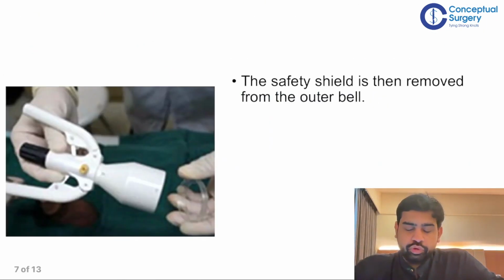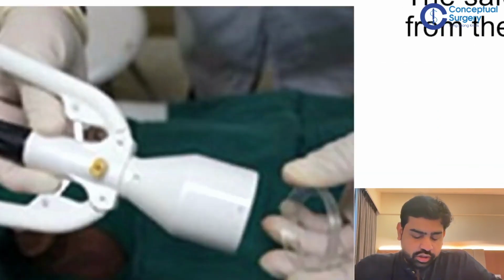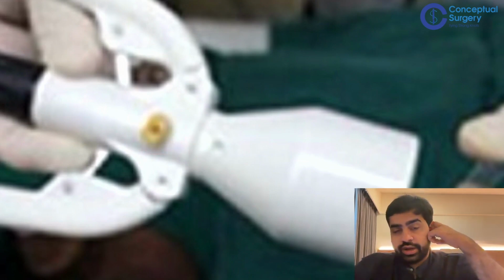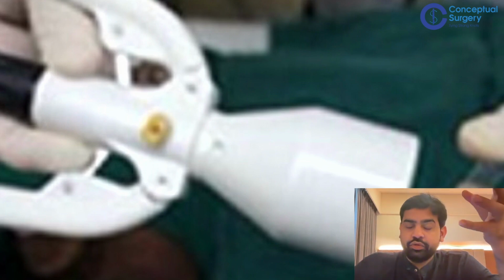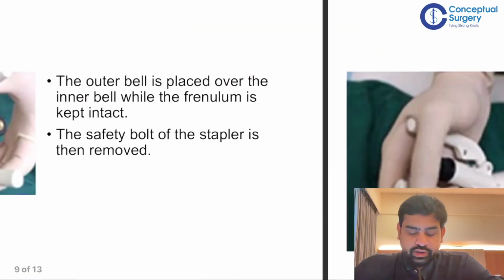Now you come to the outer bell. There's one cover on the outer bell, the safety shield, which you remove. That's all fine. Now, are you able to appreciate this yellow colored stuff? This is a stopper. If you do not remove this, you will not be able to fire this stapler. So you can remove it at this point, or at a later point as well. I prefer to remove it at this stage.